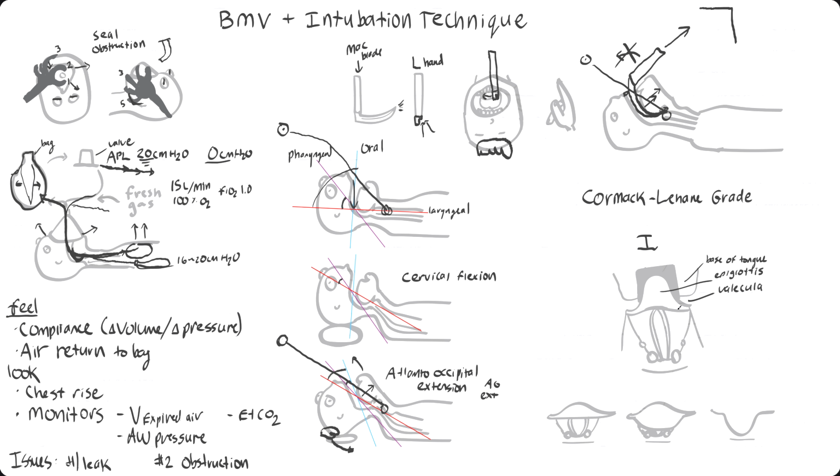If you do not get the tip of the blade right into this vallecula, it doesn't properly engage the hyoepiglottic ligament, and you may have an issue where the epiglottis is not flipped up appropriately. But this is a good view. So we've got the true cords here. And then between your cords, you'll be able to see into the trachea. So this is the anterior trachea that you're looking at, and those would be tracheal rings. You might be able to see those.